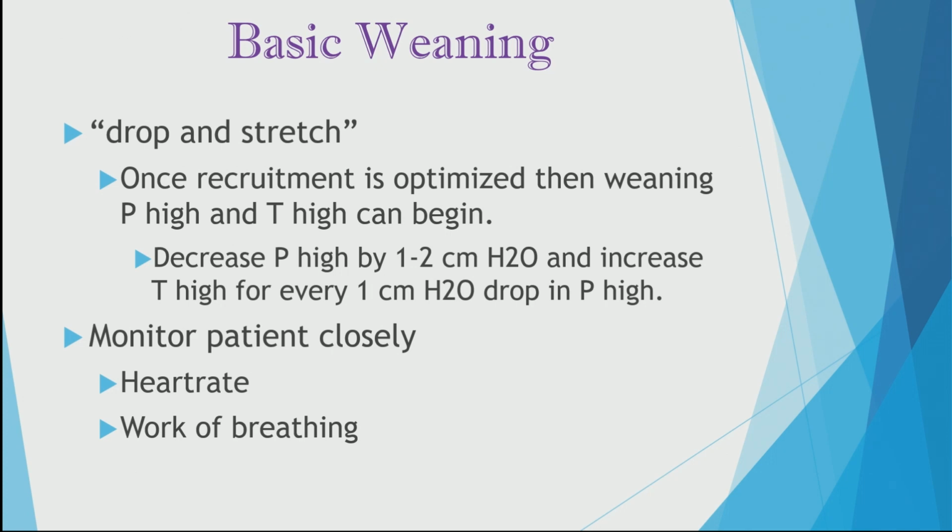Now, once your P high reaches 10 centimeters of water pressure, and your T high is somewhere probably around 12 to 15 seconds, and you're at 50% FiO2, why don't you just try changing over to CPAP of 10, pressure support of 10.